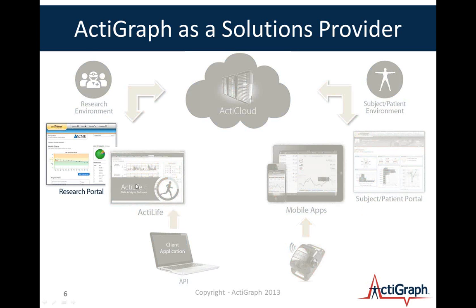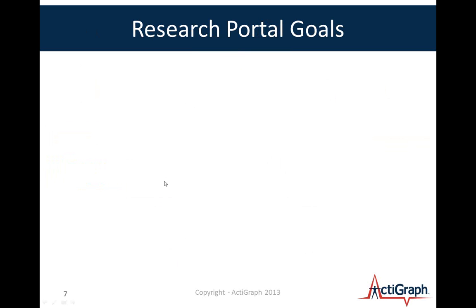But today we're specifically going to talk about the research portal, and I've titled it Research Portal here, but you'll hear me say Research Portal or Study Admin Portal. And the idea is that you as a research team or a clinical team are able to manage a number of subjects and a number of devices through a single interface. And I want to talk a little bit about why that might be beneficial to you as a client.